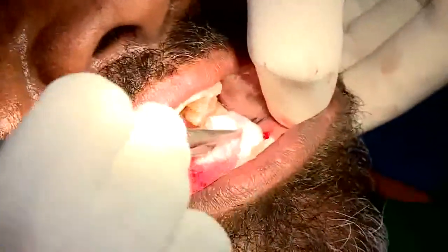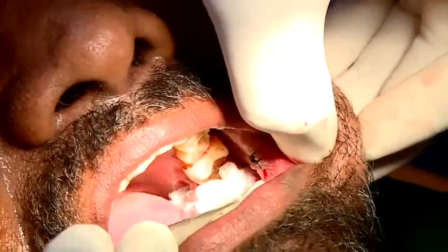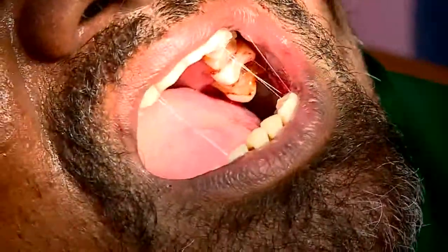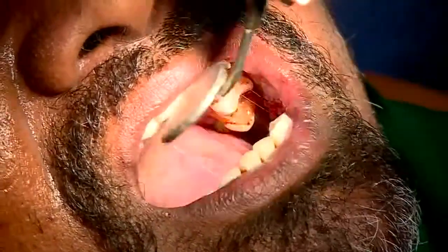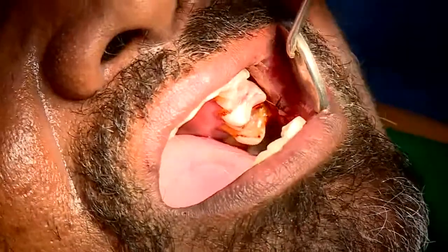Yeah, again the size of the specimen matters, because once you put it into a fixative, the tissue is going to shrink. So if you give a very little tissue, it will be of no use to the pathologist. So give an adequate specimen size, because after fixation your tissue is going to shrink and the tissue size should adequately compensate for the shrinkage.